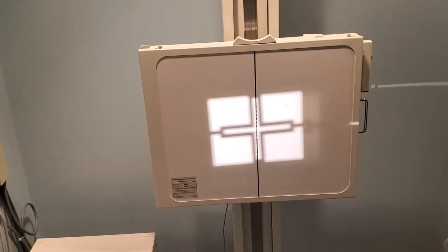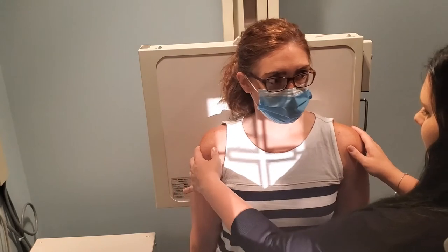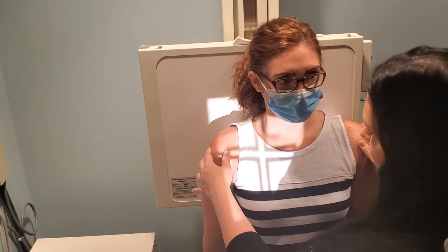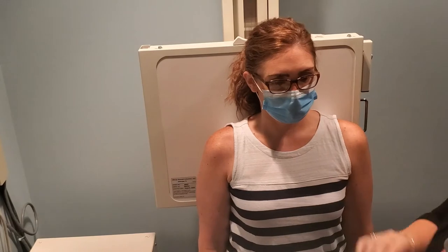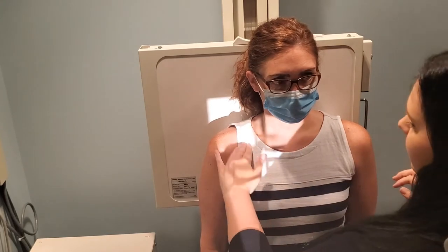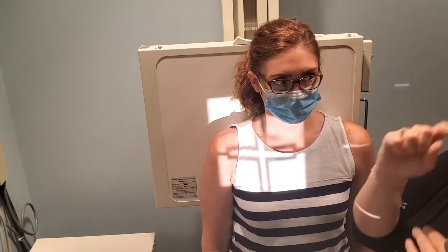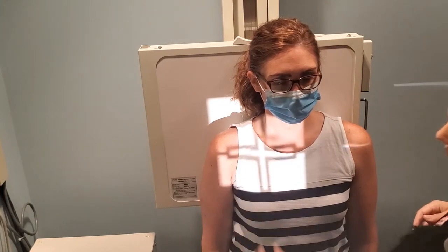So I'm going to have my patient come over. And you're going to be centering just below the coracoid. If you feel in your own body right below the humeral head or right below the clavicle, there's a little — it feels like a little button. Don't push it too hard on your patient because it actually hurts quite a bit, but it should just be a little rounded prominence. You're going to be centering just below that.